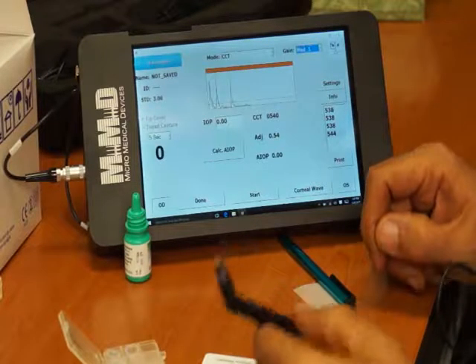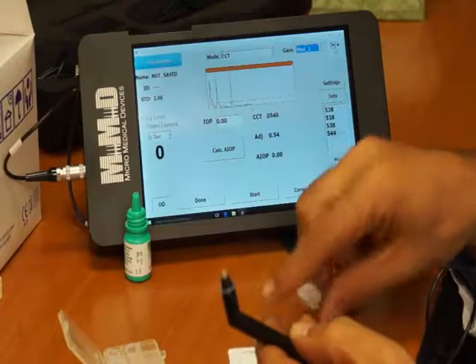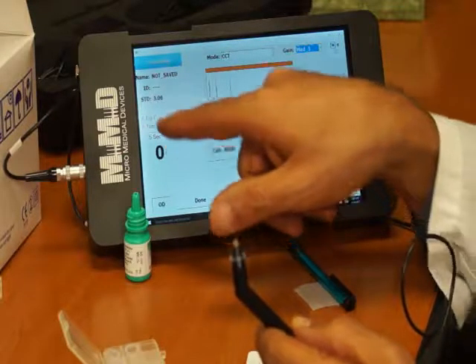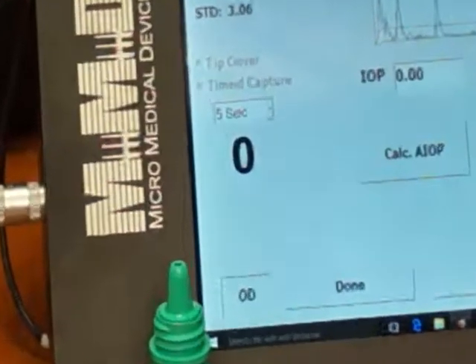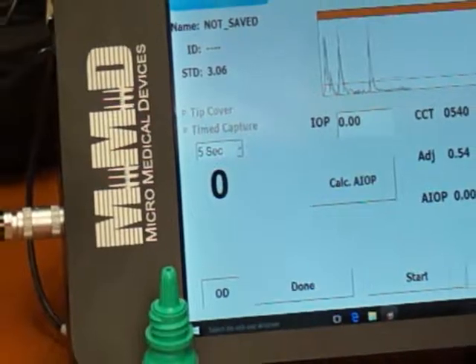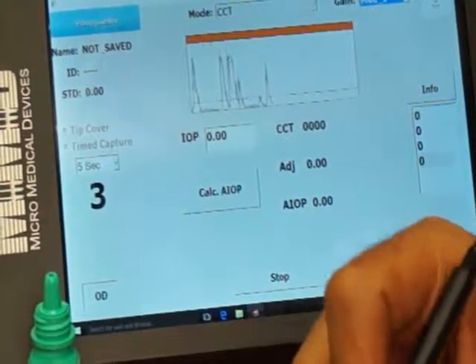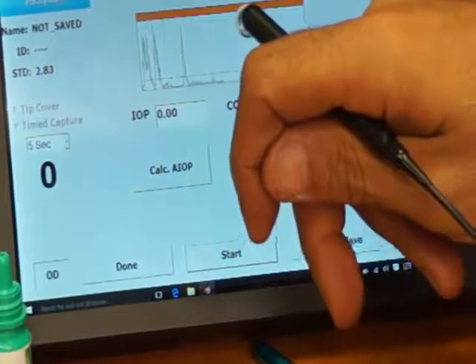Now I'm going to show you how to correctly measure the calibration card, and in the process you will learn how to measure the eye properly. So for this, I place the timer at about 5 seconds just to give me time to confirm that I'm getting multiple echoes. Get ready. There you go. So you can see 538.